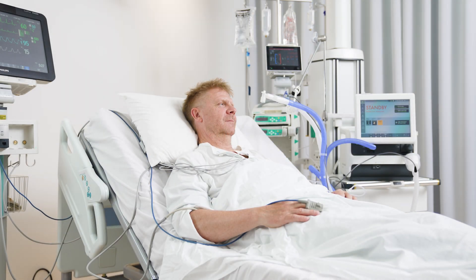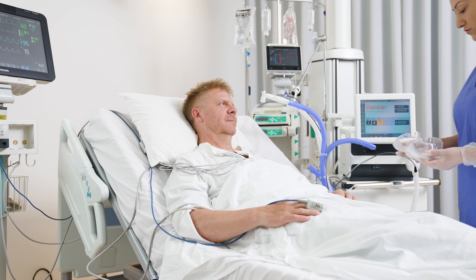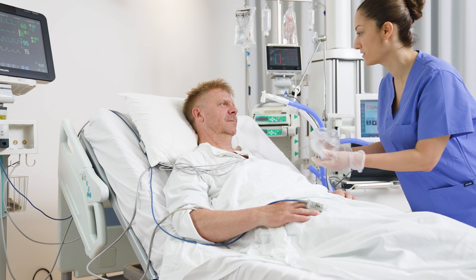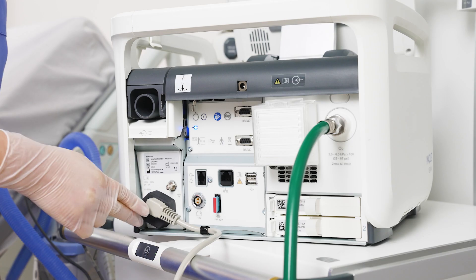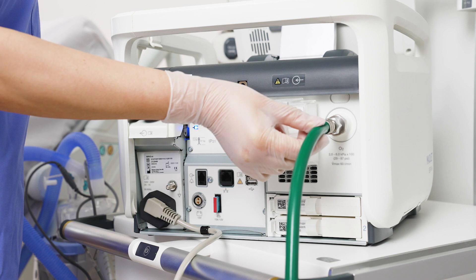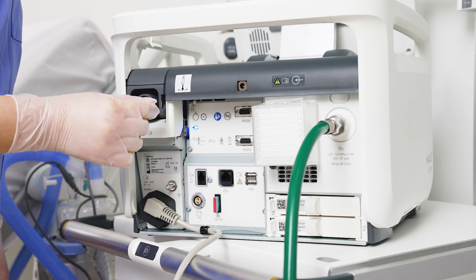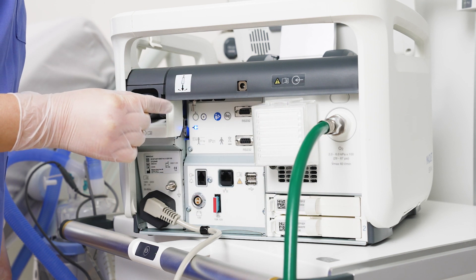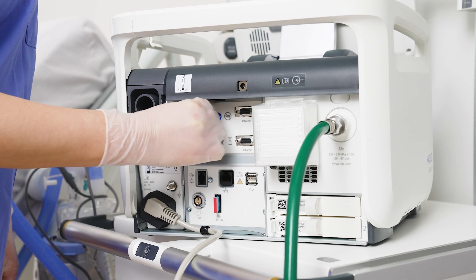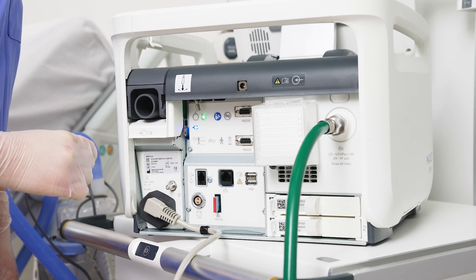This is how to get started using non-invasive ventilation on the ServoAir ventilator. Plug in the power cord, connect the oxygen hose, and switch on the ventilator here by pulling down and moving over.